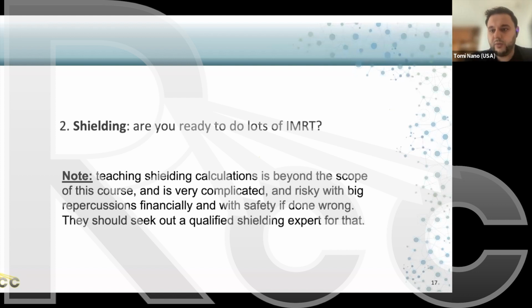So with inverse planning, we're not deciding where the MLC leaves should go. An algorithm is deciding that. And for the longest time historically, we really wanted to be sure that that algorithm was computing things correctly, which is why our QA procedures around IMRT early on were very strict because it was a new technique, but also we wanted to make sure that the algorithms weren't computing something nonsensical. And that's why inverse planning and IMRT comes with a lot more QA and patient-specific QA. But without rambling on too much, that's the difference between forward and inverse planning.